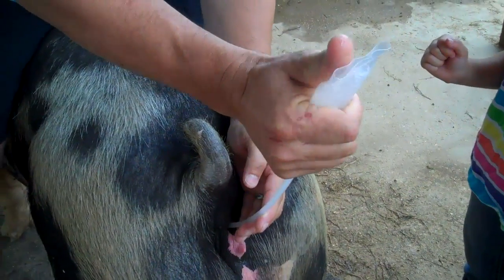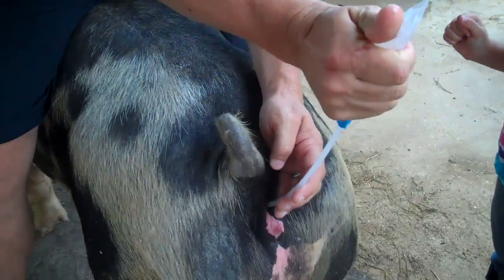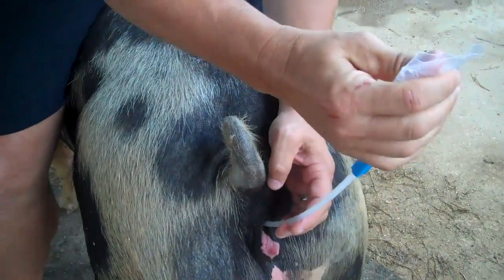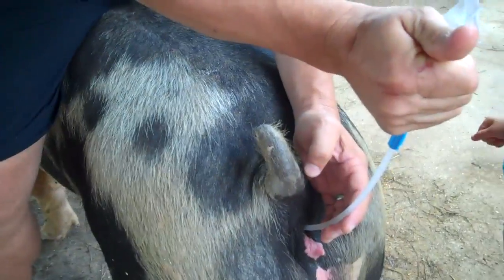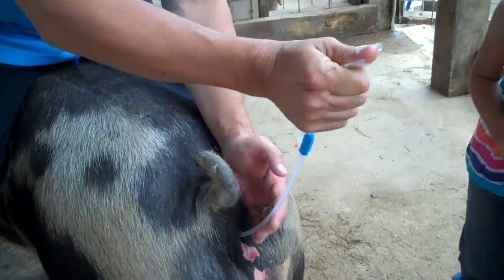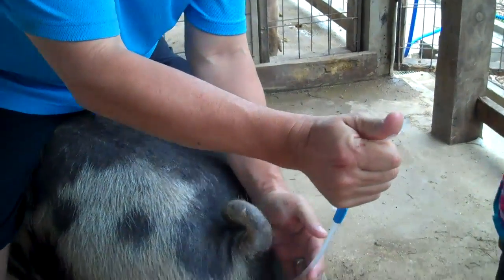Gently squeeze the tube — it's going in, it's going in. This should take about two or three minutes to get all the semen in. All of it? Yep. I'll get some more.